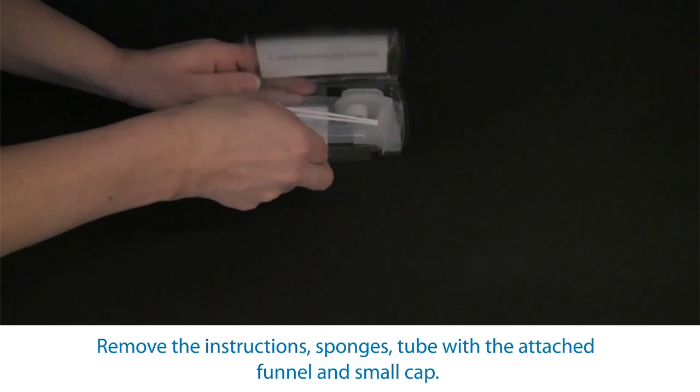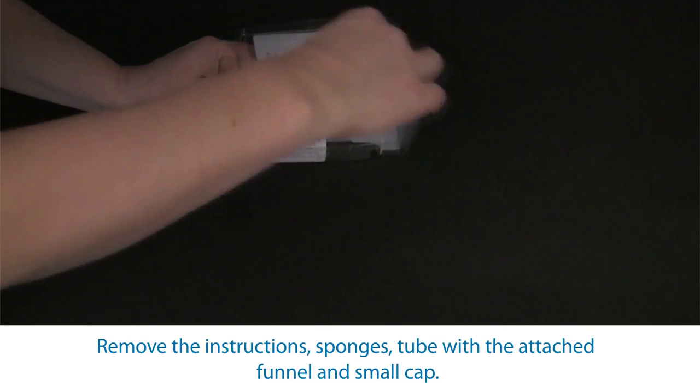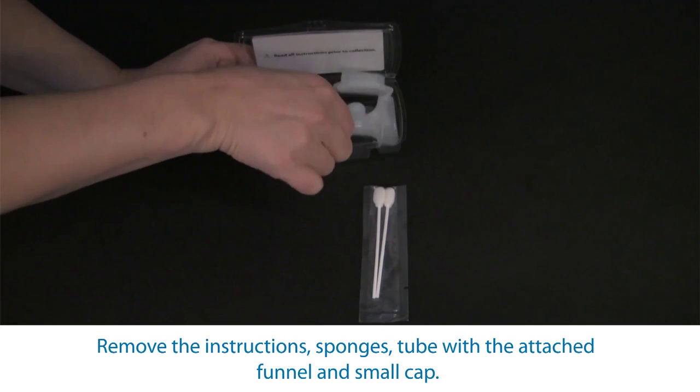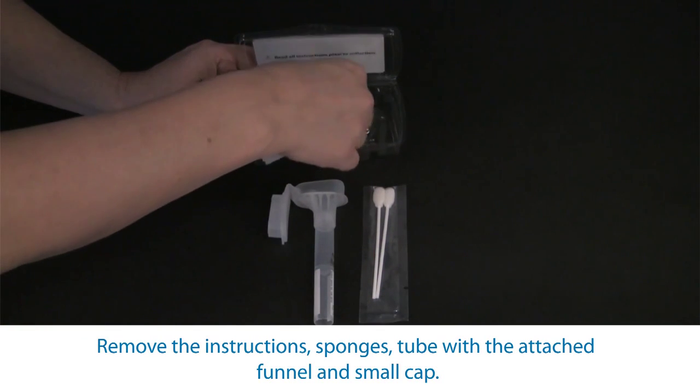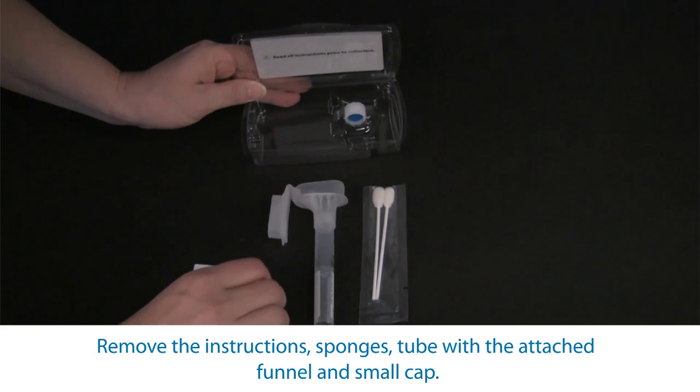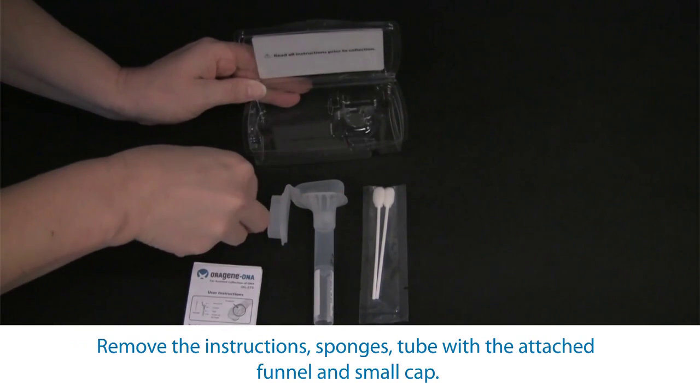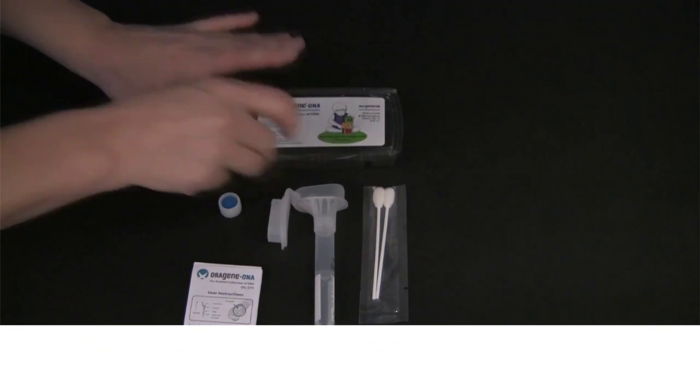Included inside the kit are user instructions, two sponges, a collection tube with attached funnel and a small cap. Do not allow those requiring supervision to handle the sponges or small cap as they may present a choking hazard.